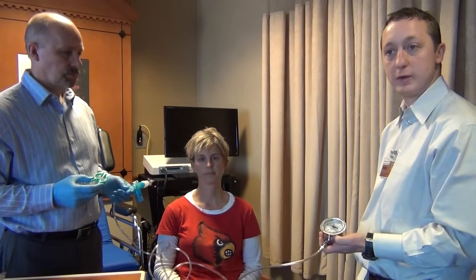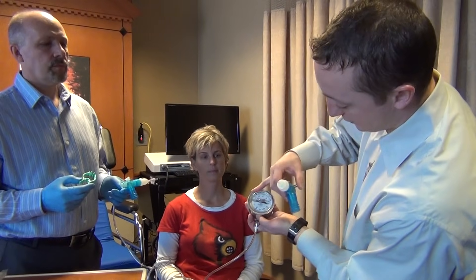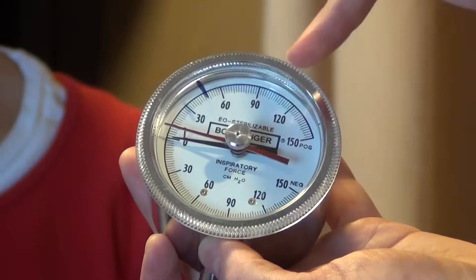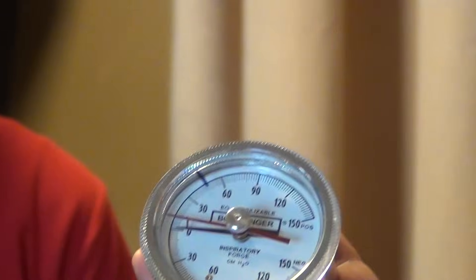We're going to do the maximum expiratory pressure test. This is the manometer. Before the test starts, you want to make sure that the red reference arrow is on top of the black arrow. Whenever the subject blows through it, the black arrow will move and the red arrow will stop at the peak point. That's how you read it.